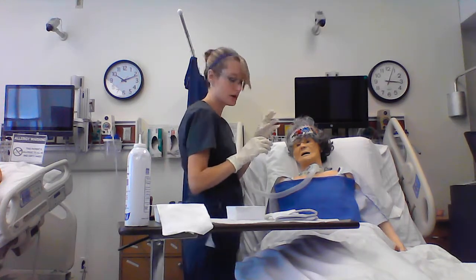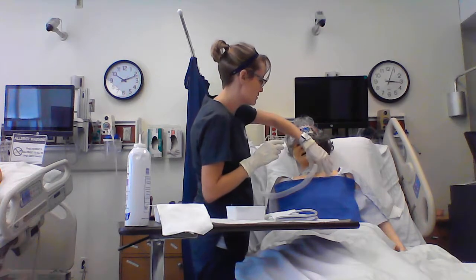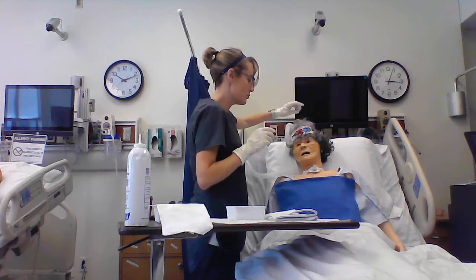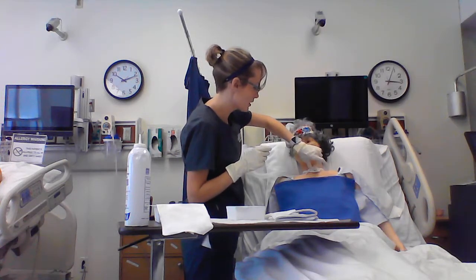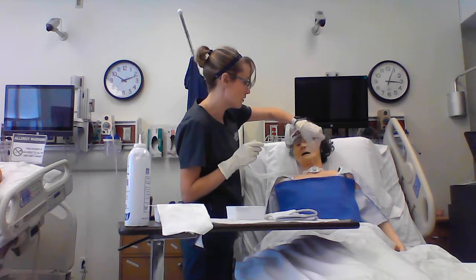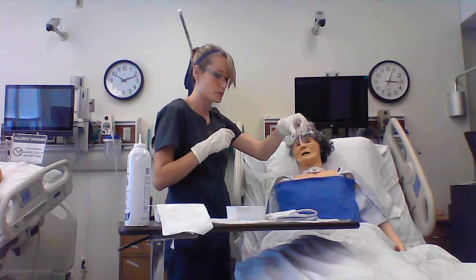I need to contaminate one hand. So I'm going to pull her oxygen off. Again, if you need to reoxygenate her at any point in time, if she becomes distressed, you can do that. And then go get a new pair of sterile gloves. Don and doff as needed and continue your procedure here.